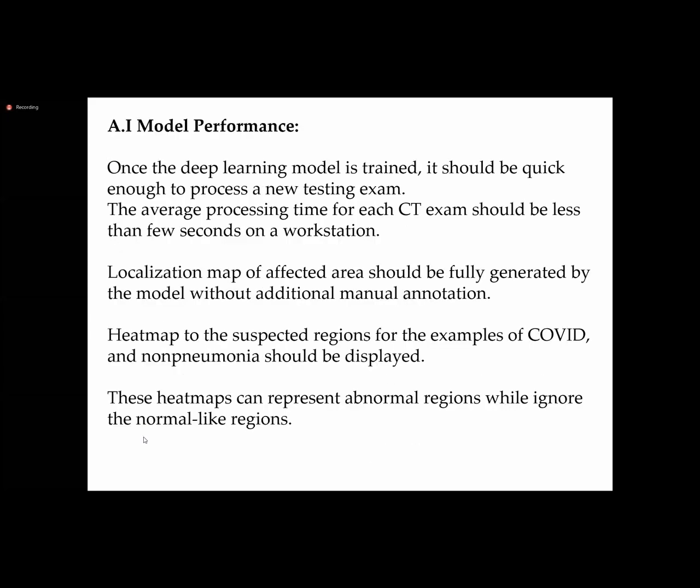Once the deep learning model is trained, it should be quick enough to process a new testing exam. The average processing time for each CT exam should be less than a few seconds on a workstation. The localization map of affected areas should be fully generated by the model without additional manual annotations. And the heat map to suspect the region of interest, for example COVID-19 and non-pneumonic, should be displayed.